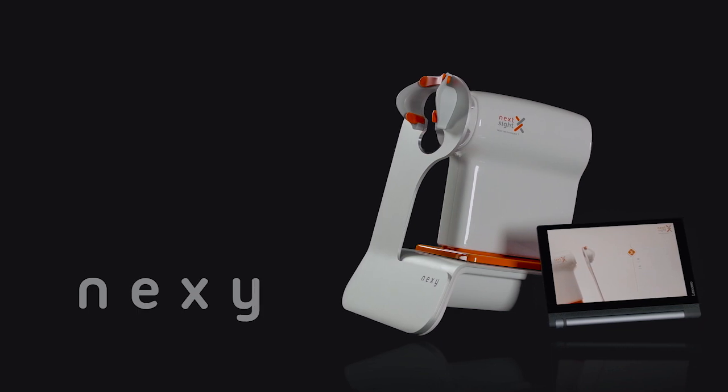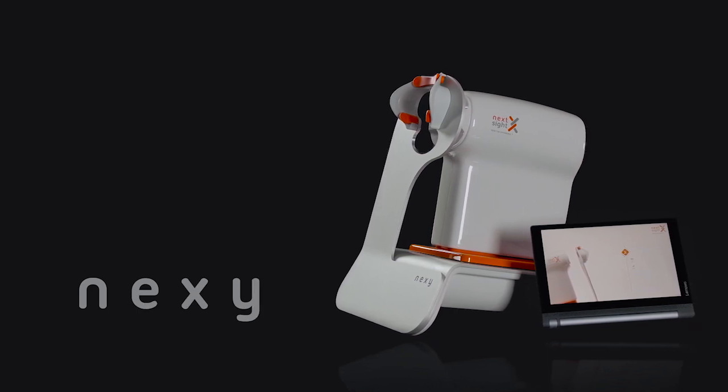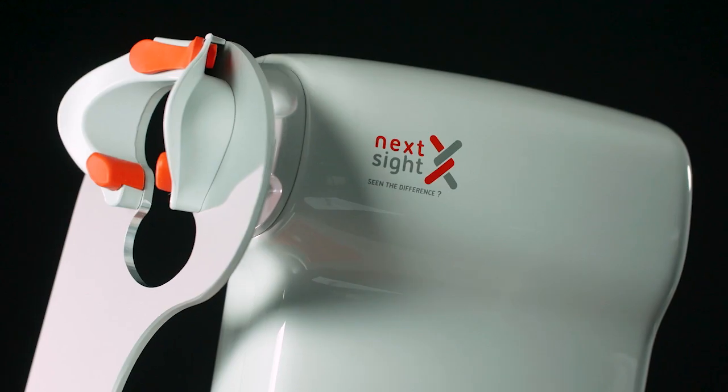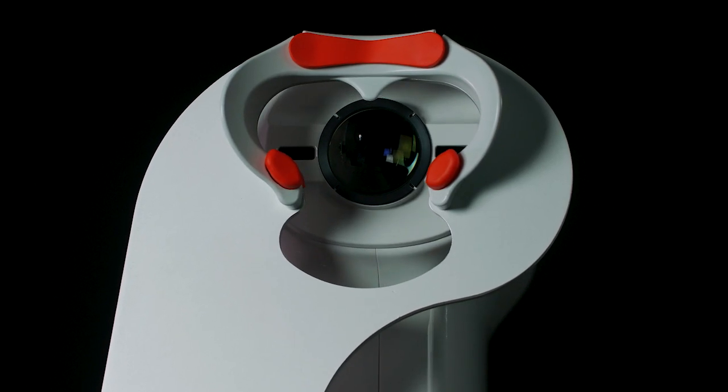Nexi is an automated non-mydriatic fundus camera capable of delivering high-definition color images of the ocular fundus with a 45-degree angle of view.